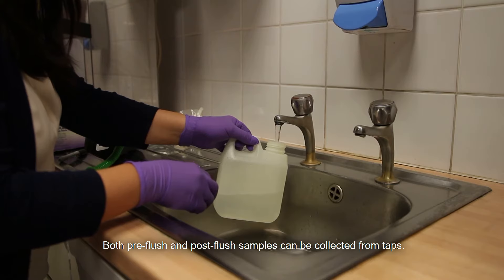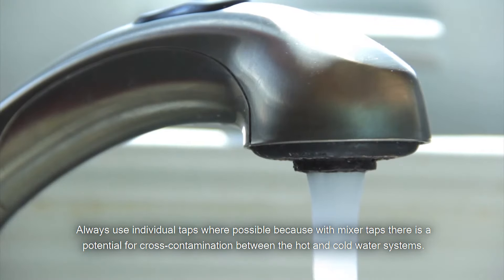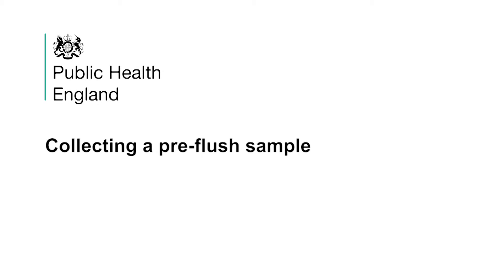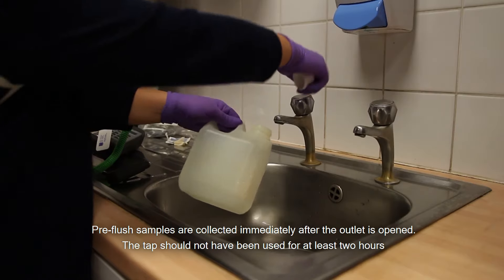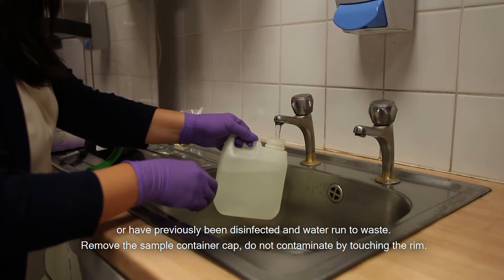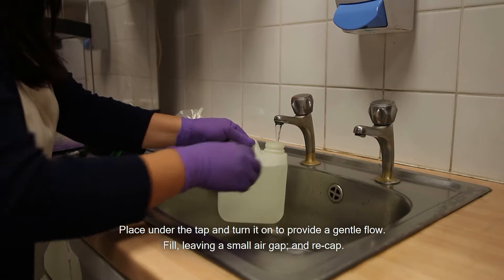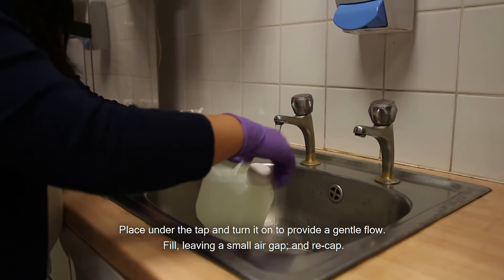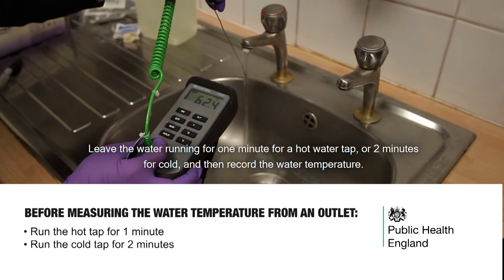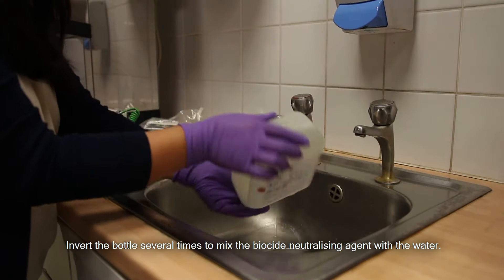Both pre-flush and post-flush samples can be collected from taps. Always use individual taps where possible because with mixer taps there is a potential for cross-contamination between the hot and cold water systems. Pre-flush samples are collected immediately after the outlet is opened. The tap should not have been used for at least 2 hours, or have previously been disinfected and water run to waste. Remove the sample container cap without contaminating it by touching the rim. Place it under the tap and turn it on to provide a gentle flow. Fill, leaving a small air gap, and recap. Leave the water running for 1 minute for a hot water tap or 2 minutes for cold, and then record the water temperature. Invert the bottle several times to mix the biocide neutralising agent with the water.